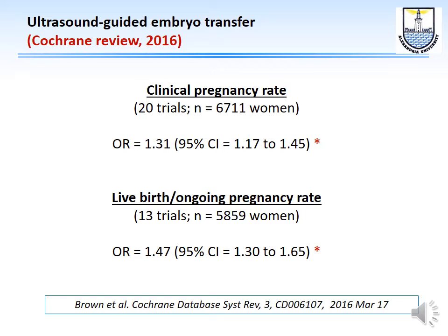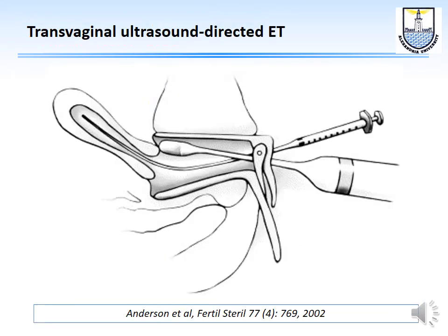Now the new Cochrane review, which was published in 2016, as you can see here, confirms that yes, when you do ultrasound-guided embryo transfer, you have a better clinical pregnancy rate as well as a better live birth rate.